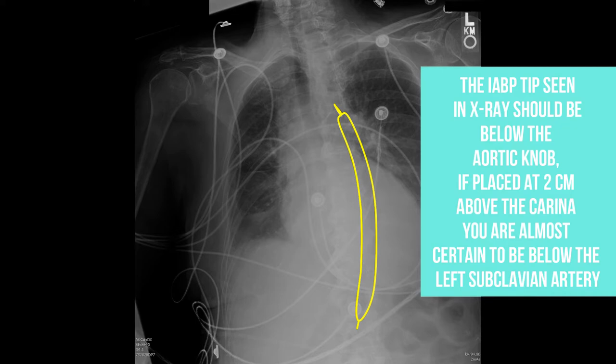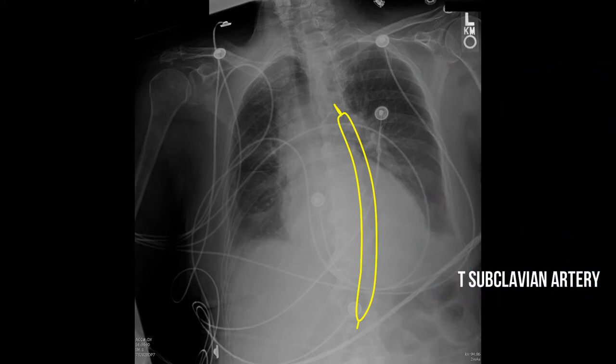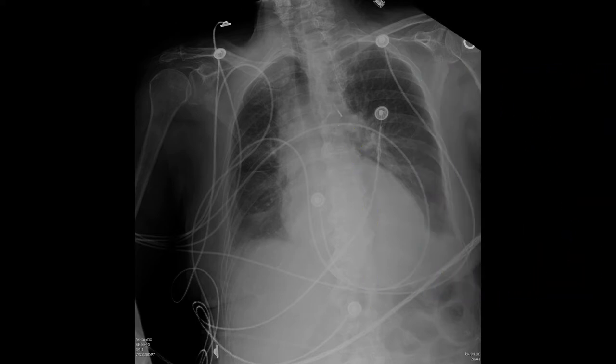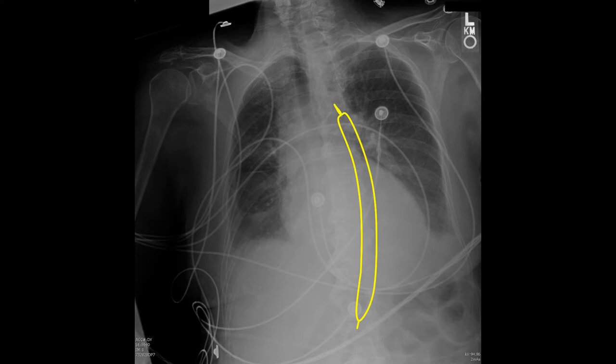Here you see the inflated balloon on the chest x-ray, and you can notice the blackness — the air — on the thoracic aorta. Again the markers of the balloon pump are visible, and we depict them with color just to aid visualization.